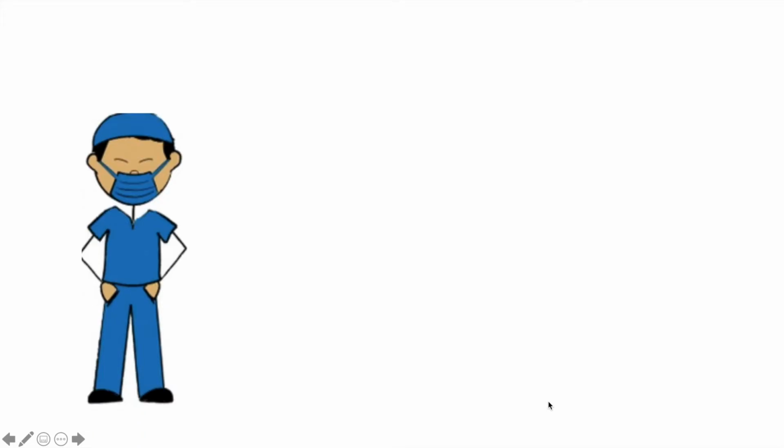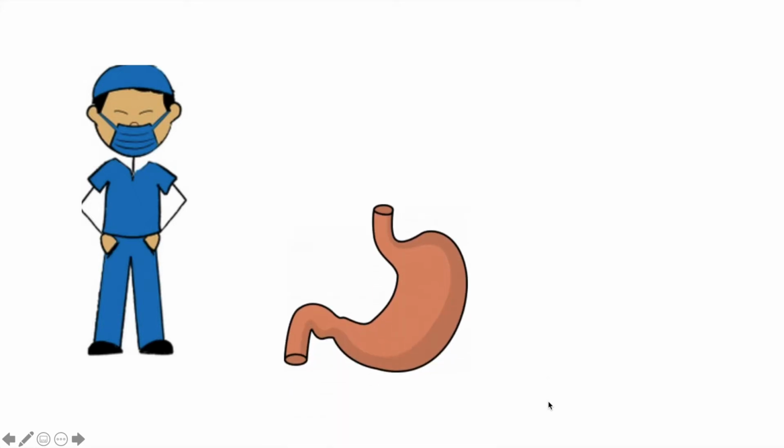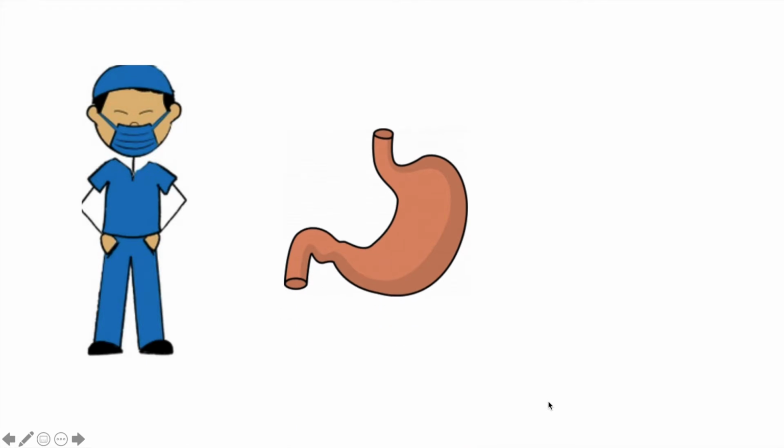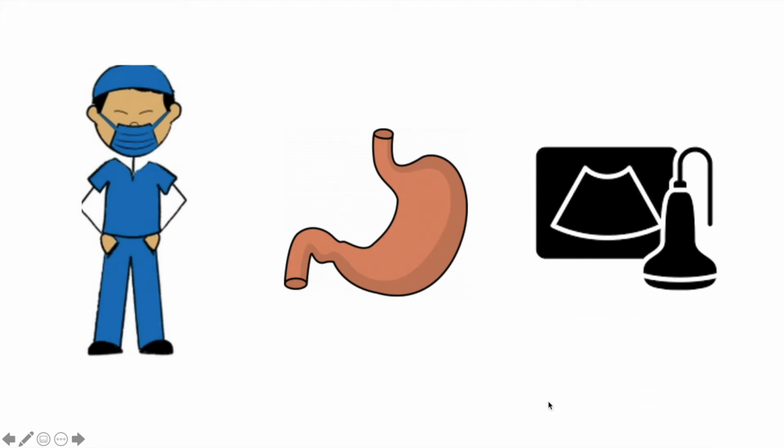Aspiration of gastric contents is an anesthesia-related complication that carries significant morbidity and mortality. Current prevention strategies rely on asking when the patient's last meal was, history, and recommended fasting periods. Certain conditions or situations can preclude the NPO guidelines' use or decrease its sensitivity.